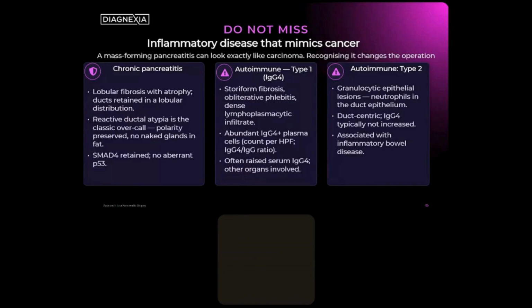And very importantly, you don't get these aberrant glands stuck in the middle of fat with nothing around it, especially if they are irregularly shaped or next to a large vessel. So if you see these single glands not accompanied by anything, with no intervening acinar tissue between, say, a vessel and the gland, be suspicious for adenocarcinoma.